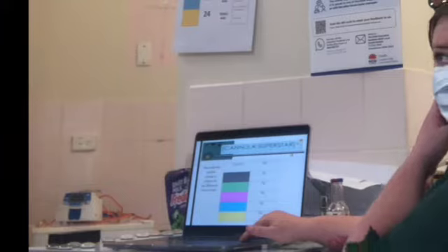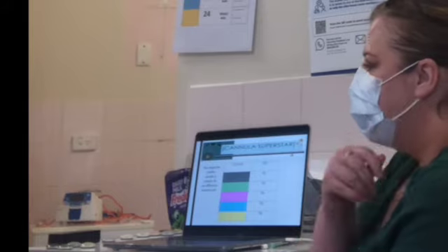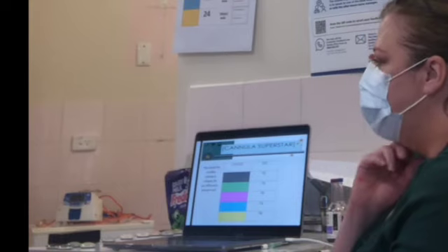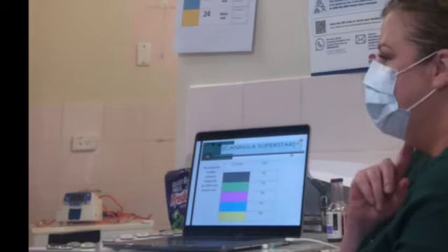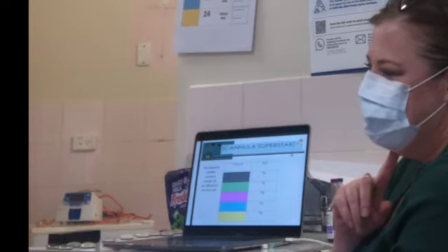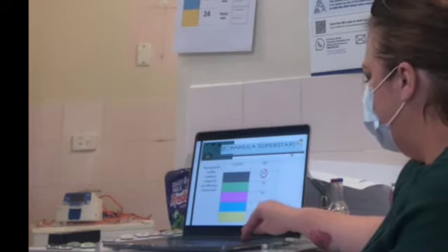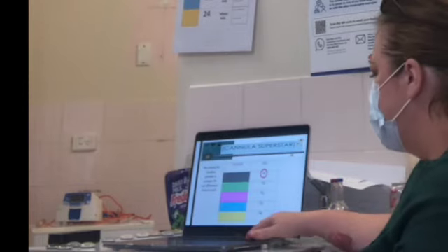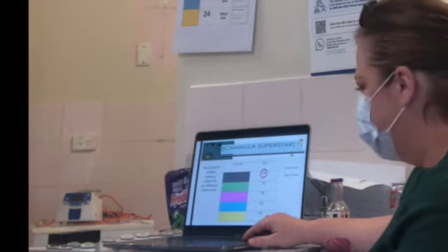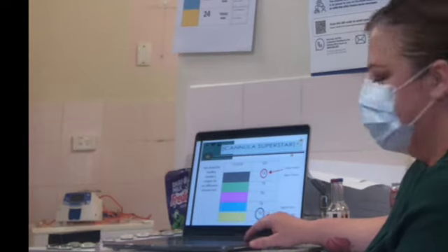So I think the answer is definitely yes. So I'm passing around this little chart here. Now often we don't play with the cannulas once they're in the patient's skin, so you've got no idea how big they are. So I want you to have a little flick of the 16 and see how firm that is. And then go all the way down to the 24 and just see the difference between the sizes. So for those playing at home, we know the numbers are a bit backwards with cannulas. So the smallest number is a size 16, but that's actually the biggest cannula. And the biggest number, which is a 24, is a baby cannula.